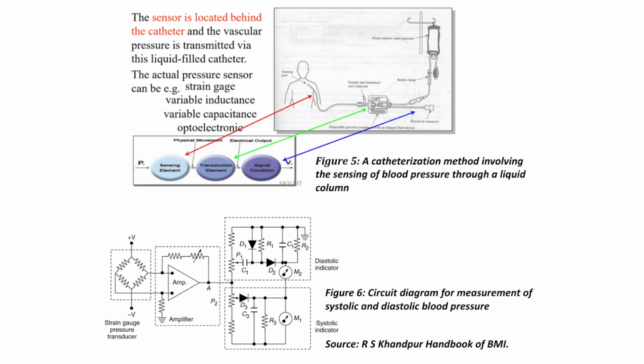The given figure shows a simplified circuit diagram commonly used for processing the electrical signals received from the pressure transducer for the measurement of arterial pressure. The transducer is excited with a 5 volt DC excitation. The electrical signal corresponding to the arterial pressure obtained by the transducer is amplified in an operational amplifier or a carrier amplifier. The modern preamplifiers for processing pressure signals are of the isolated type and therefore comprise floating and grounded circuits similar to ECG amplifiers.